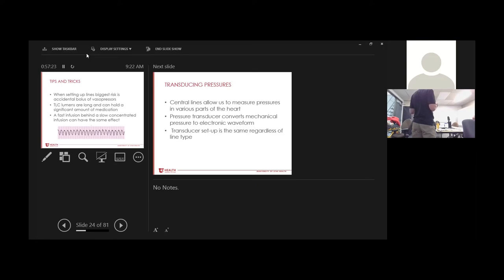When you put pressors together, which you will often, that's when you're really looking at the slow and the fast. And if you have one pressor and one non-pressor, bleed the pressor into the other drug, and it's kind of a carrier. And you're not going to bolus the pressors that way.